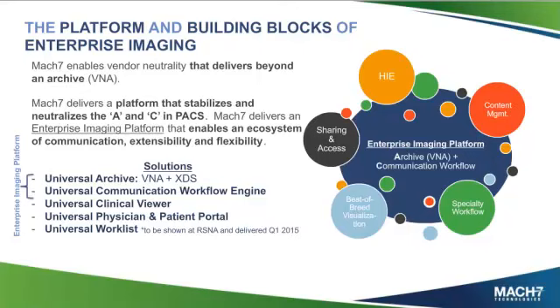But in the interim, I think there's a few different ways. One, certainly there are different PACS vendors on the market today which have interfaces that we can communicate with. For instance, over HL7, it's a standard communication, but the content of it may be a little more private. So, we may use an order message with a tag of delete in it, for a particular accession number and study instance UID and things like that. So there are some vendors that have interfaces like that we can work with.